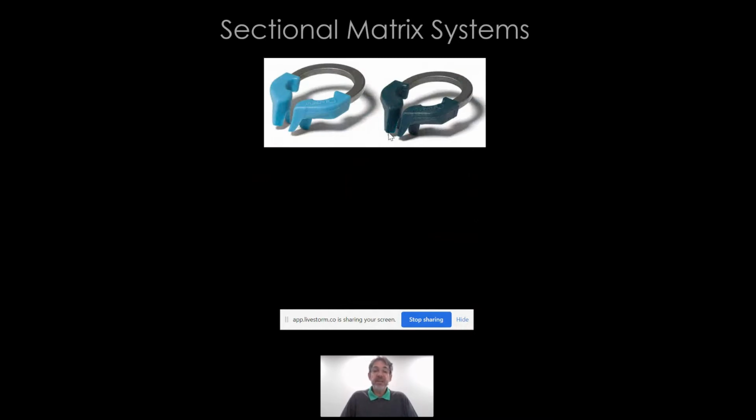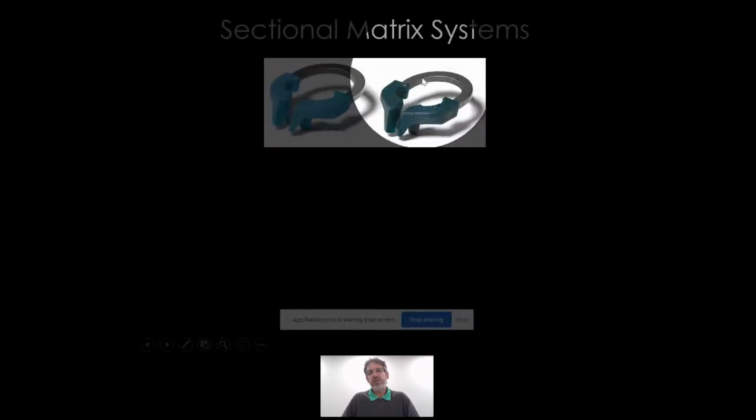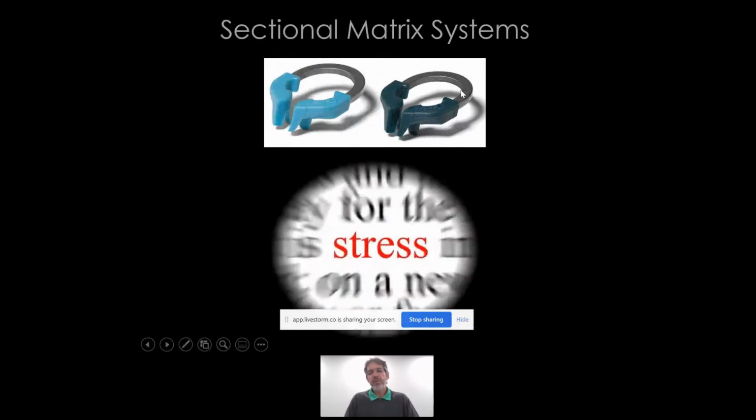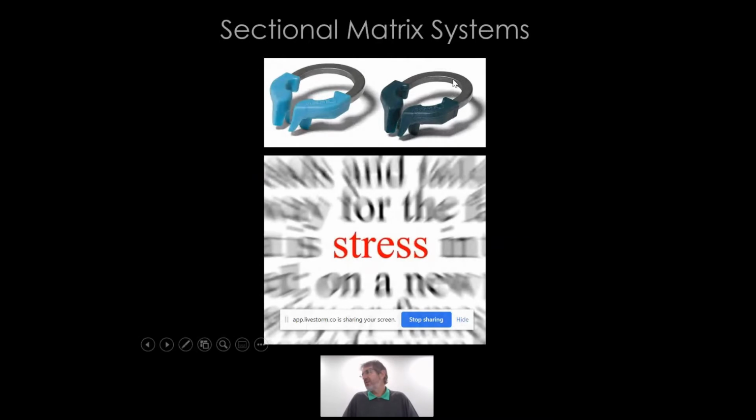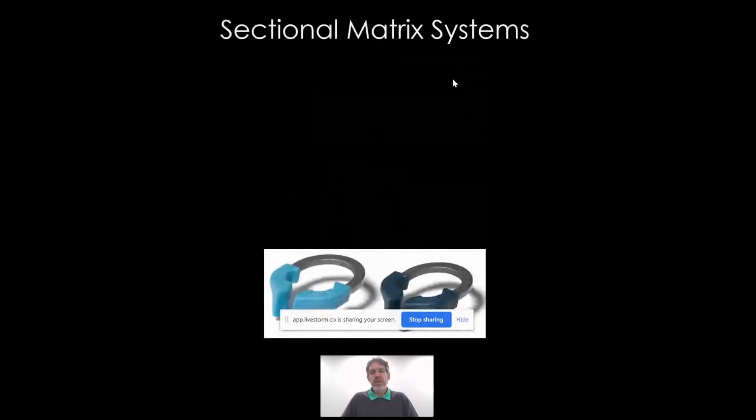So as I alluded to, certainly the Triodent developed by Simon McDonald in 2008 out of New Zealand was certainly a step in the right direction. Why? Because they went from stainless steel to stamped nickel titanium. So they had these sheets of nickel titanium, and they stamped the rings out. But here's the issue with these rings: when you look at the shape of the ring, you'll notice that it's U-shaped. It's not round. So every time you open the ring, you create stress right over there, and hence the reason why, again, sometimes these rings can break prematurely.